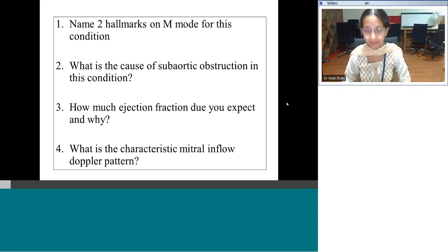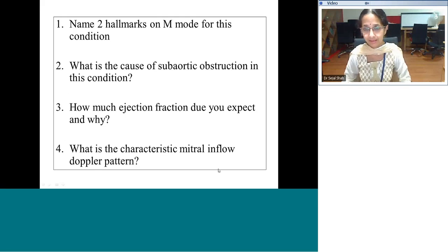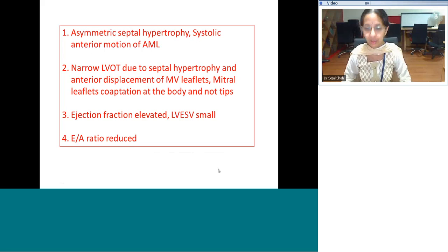See, the thing is that mid-diastolic wave. Okay, the thing is that cardiomyopathies, commonly we do not follow systematically every single point which we really need to do. So what is important for us is we need to put all the markers for all cardiomyopathies in front in the echo room, so that any child comes, we systematically do every single parameter. Especially with restriction, I think it gets very difficult when we want to understand what happens on inspiration, expiration, etc. So the more typical features are asymmetrical septal hypertrophy and systolic anterior motion of the mitral leaflet.